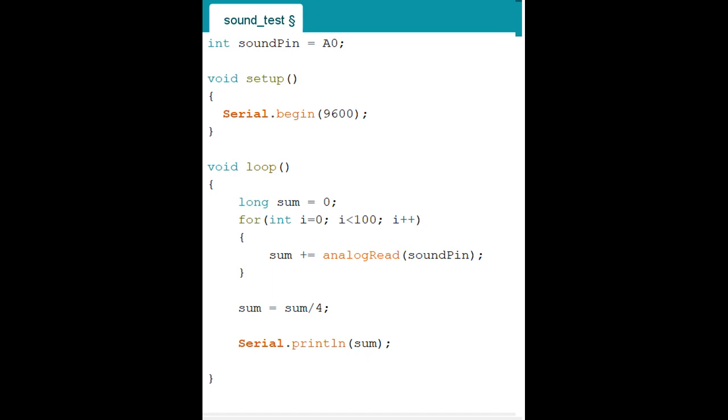Why is it 0? Because I'm assigning this number, I don't know what this number is going to end up being, but it's going to be a long number, because it's going to be the summation of everything. But right now it's 0 because the initial is 0. The computer is very blank, doesn't have any information, nothing, right? So I need to give it an initial number, otherwise your computer gets really confused. It's like, you call it sum, but I don't know where it starts, right? So it gives you an error. So now we set the initial number.